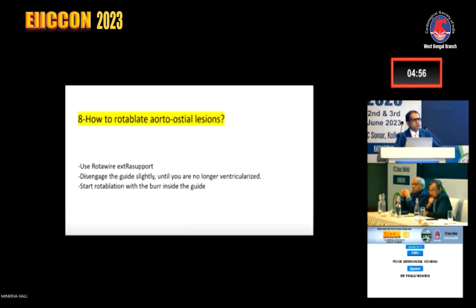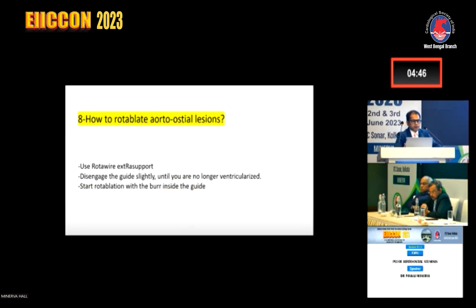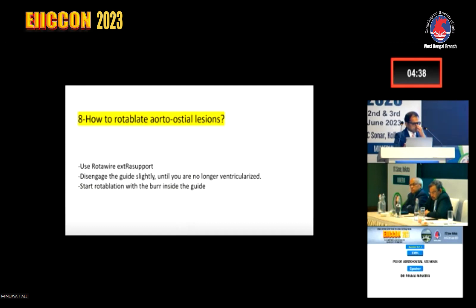Sometimes these lesions may also be calcified. Doing rotablation at an ostial lesion is very, very challenging. What we need to do is take care with an extra support rotawire, disengage the guide slightly until we are not ventricularizing, and sometimes start rotablating with the burr inside the guide to really rotablate those ostial lesions.